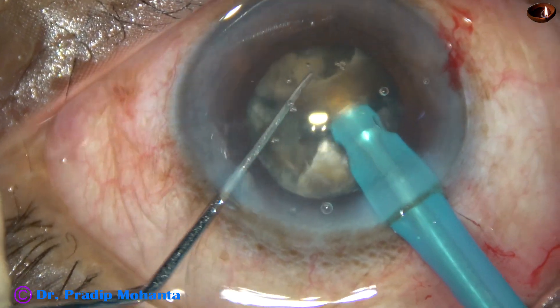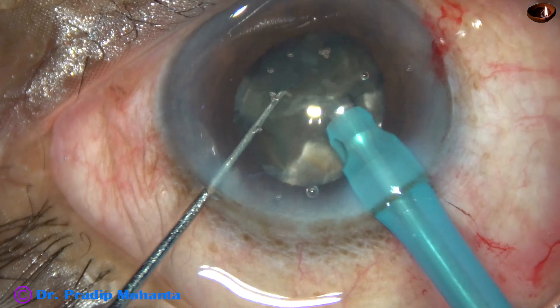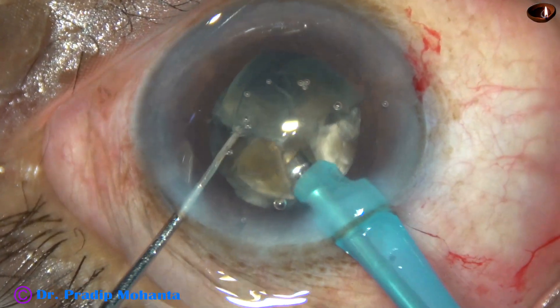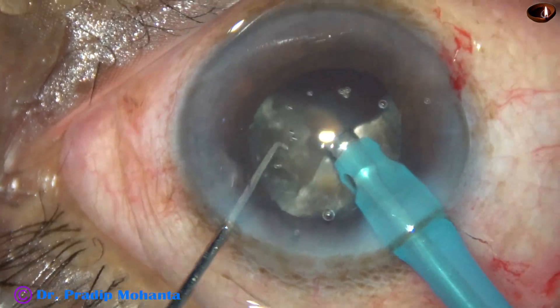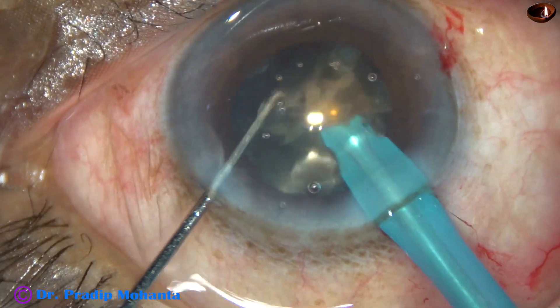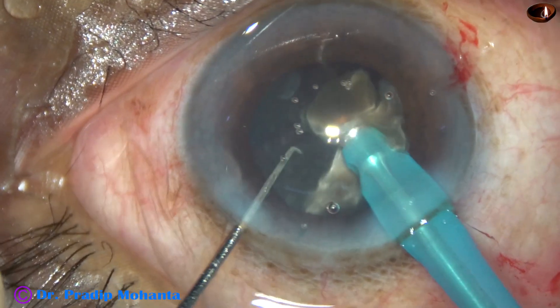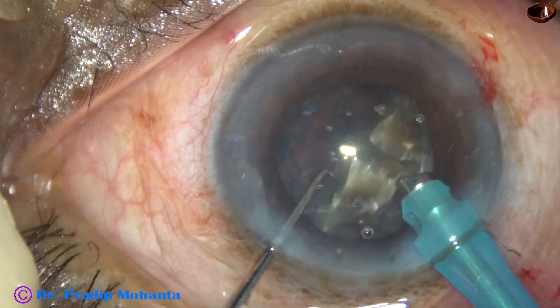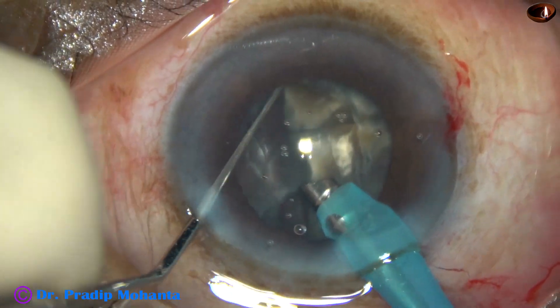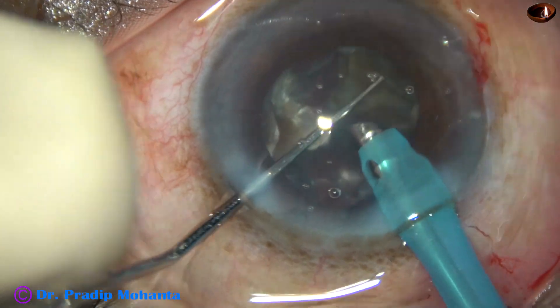Now each nuclear fragment is tilted and the apex of these large nuclear fragments is emulsified first. Ultrasonic energy used in this case is 80%, flow rate is 45 ml per minute, vacuum is 400 mmHg, and the ultrasound is in continuous mode. We can see there is no wound burn, and we will see after completion of this nucleus management there will be no wound burn.